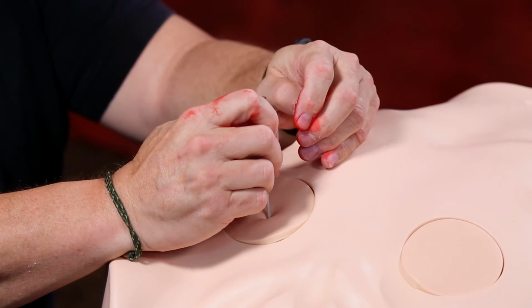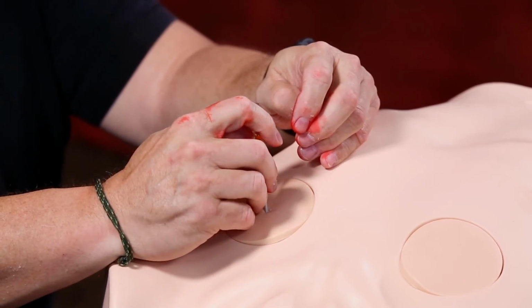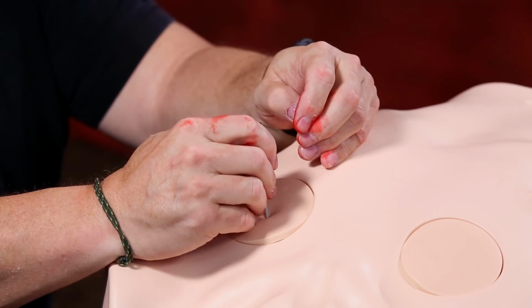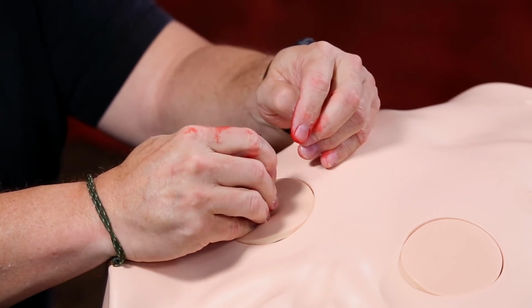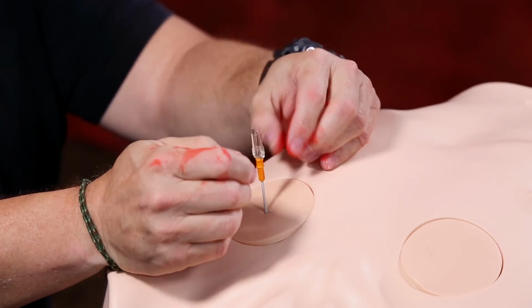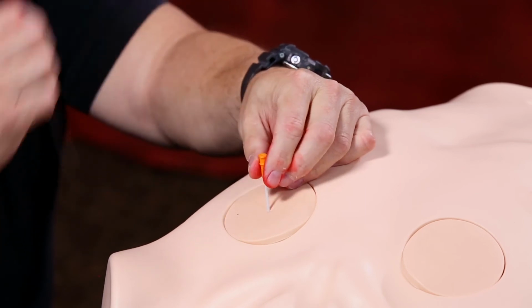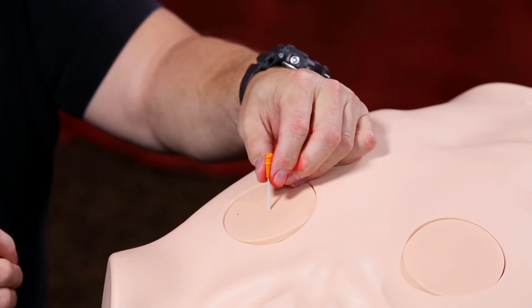As you enter the chest, it's going to take a little bit of force to push down, but as you enter that air-filled pleural cavity, you should hear a rush of air come out. Once you hear the rush of air come out, you remove your needle and leave the catheter in place.